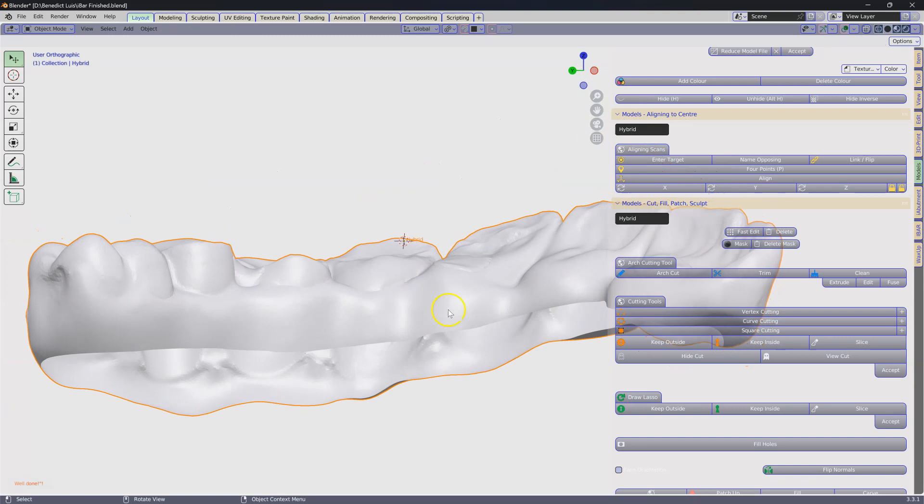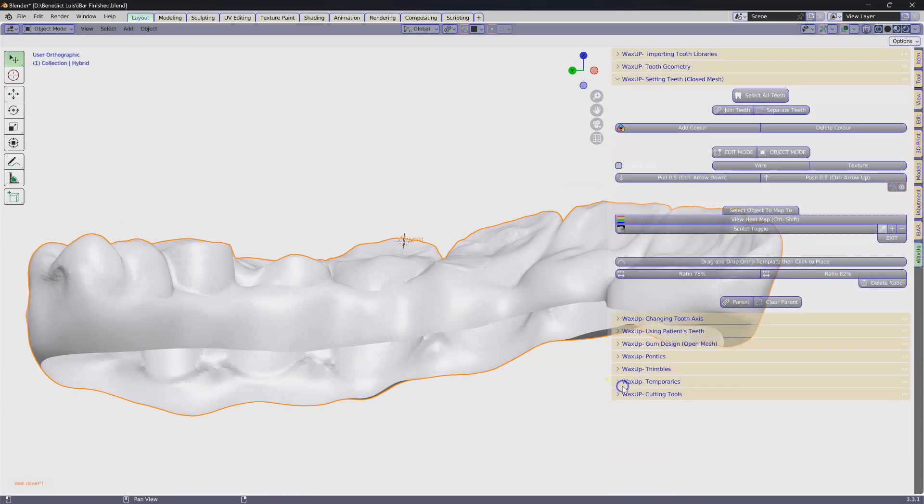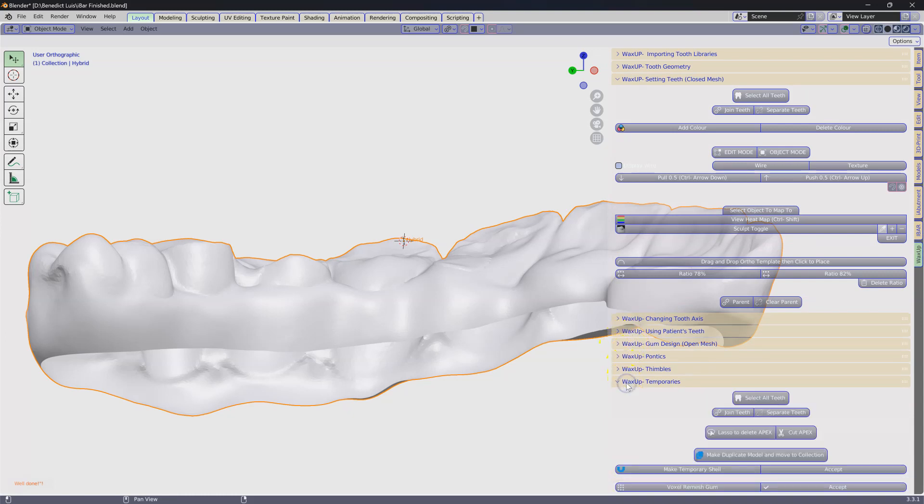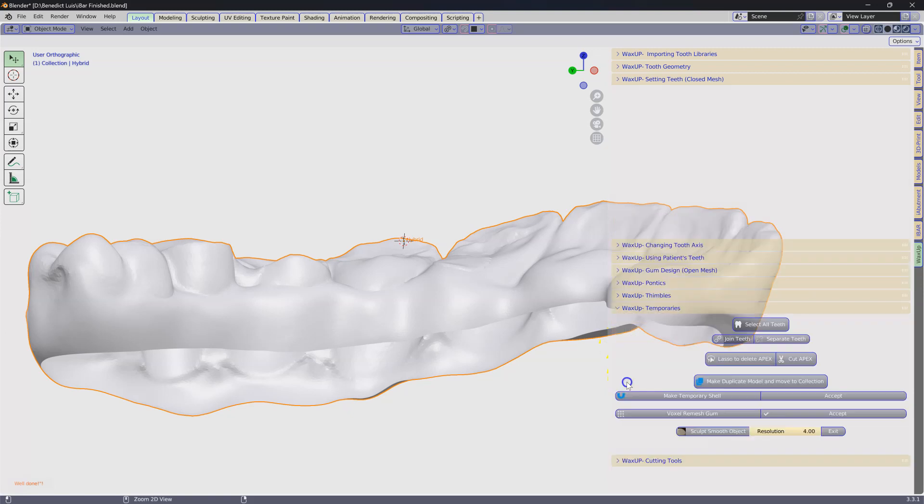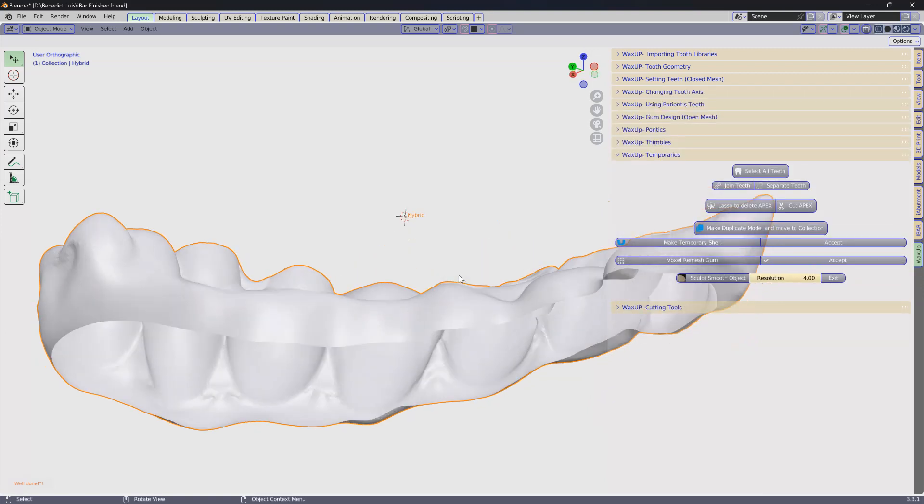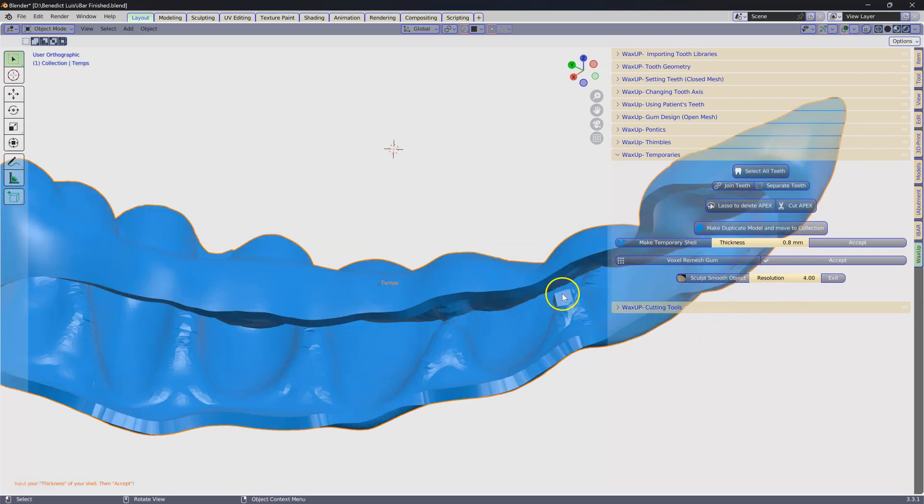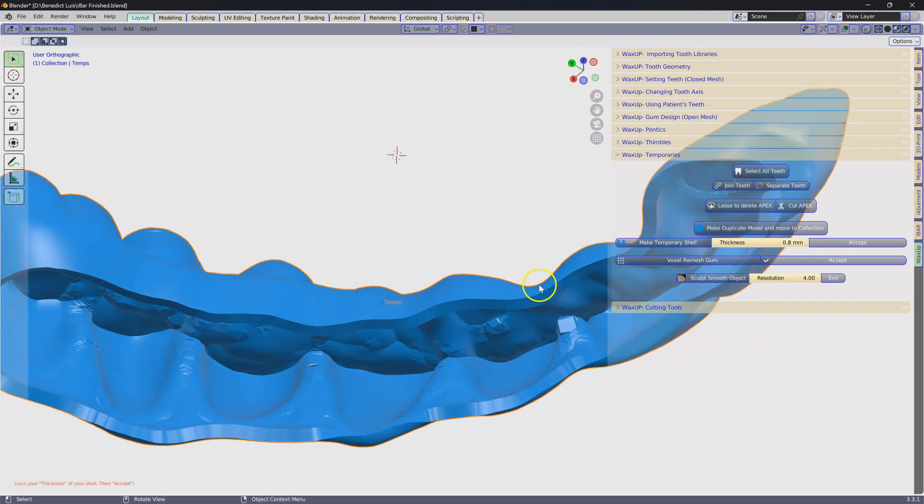Now what I'm going to do is go to the wax up module. You're going to find yourself the folder where it says temporaries. So wax up temporaries. Now this is what the temporary does. It makes an eggshell. Make temporary shell.